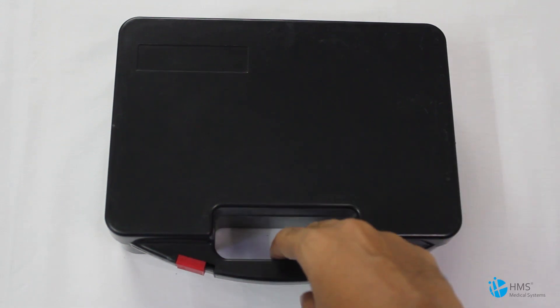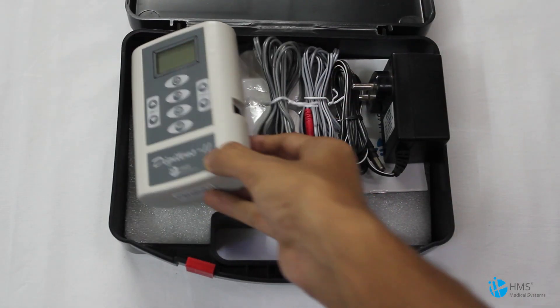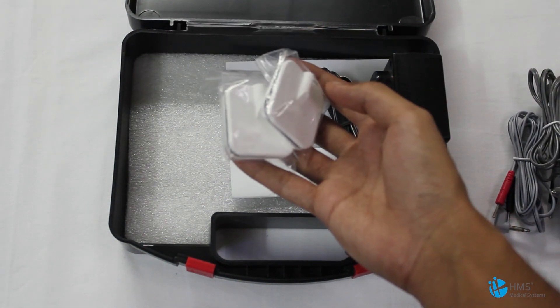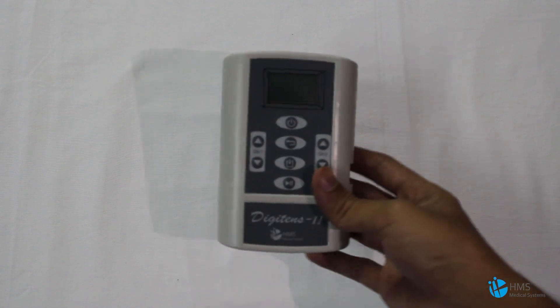Our digital second generation will come with this box out of the factory, which contains all its accessories and will be easy to carry anywhere you go. Now let's see what accessories come with the machine inside the box. As you open it, this is our second generation DigiTens from HMS. It gives you two sets of cables, two pairs of self-adhesive electrodes, an external power supply adapter, and a user manual.